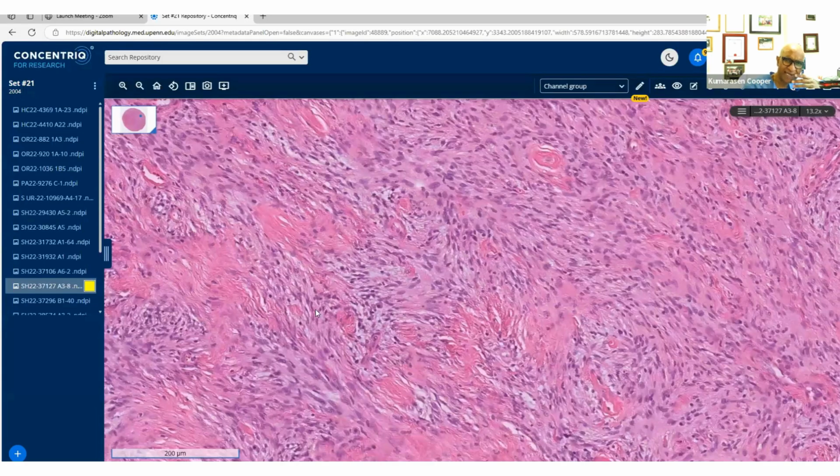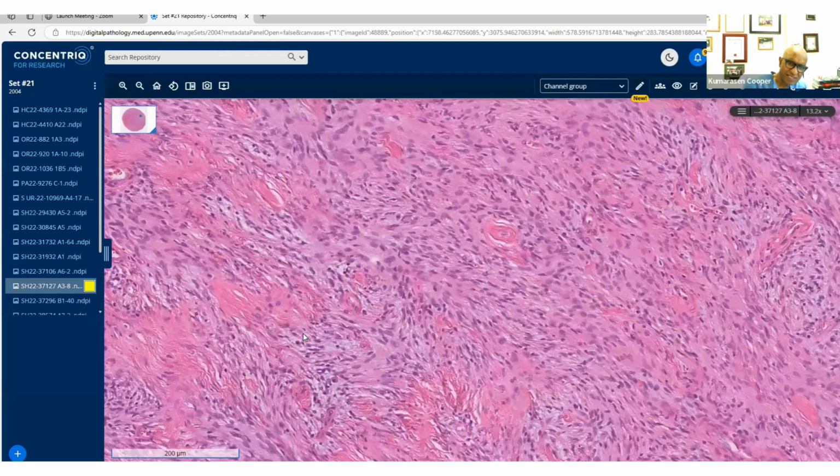My approach generally is to ask myself, is this fibroblastic? And then, like you mentioned earlier, Carla, SFT comes to mind. Could this be a solitary fibrous tumor? We've ruled that out because STAT6 is negative, but we did say CD34 is positive, just to help you along that way. Then I asked myself, well, could it be myofibroblastic?